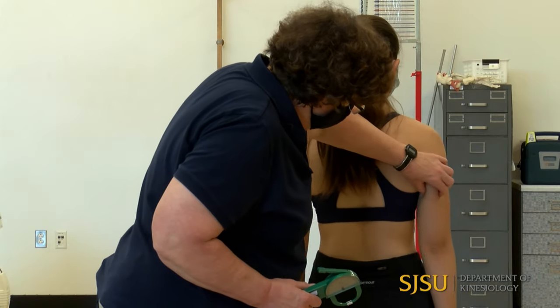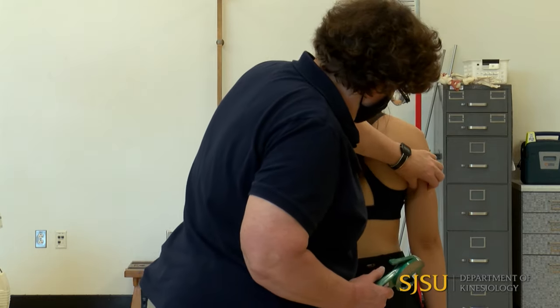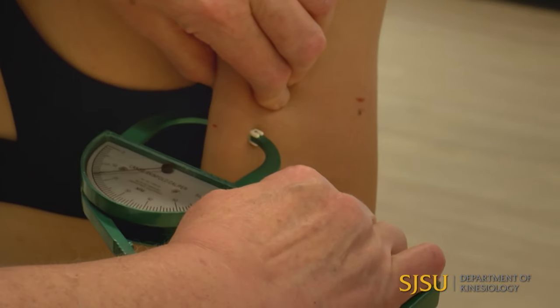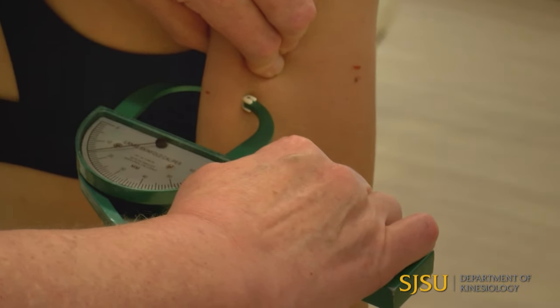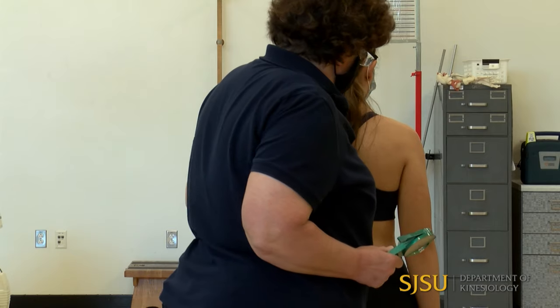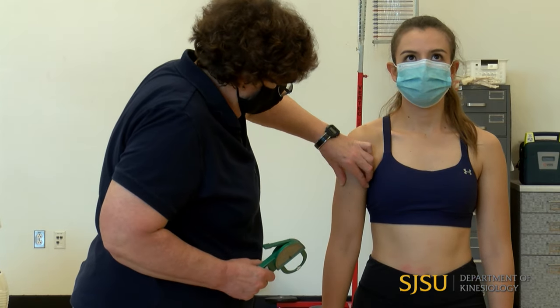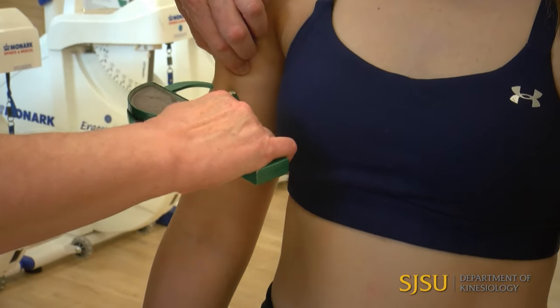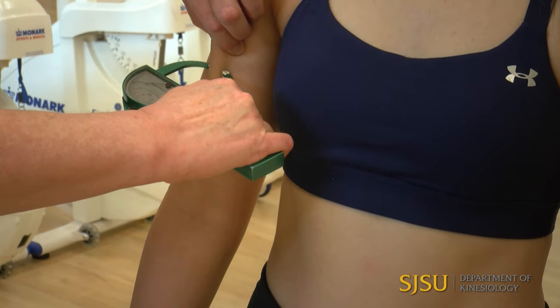For the triceps, I pinch above — it's kind of like a little hook coming down — leaving a gap between my fingers and the caliper tips, which should be right where my mark is. It's a vertical skinfold. Similarly for the biceps, I bring my fingers down, pinch right over the belly of the biceps, vertical skinfold, with a gap between my fingers and the caliper tips.